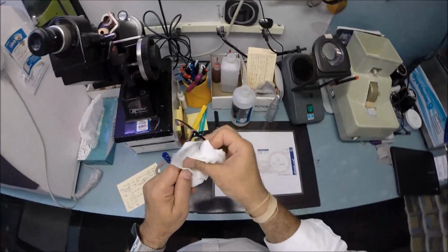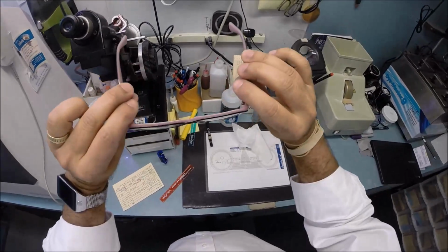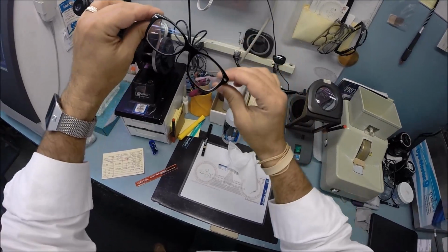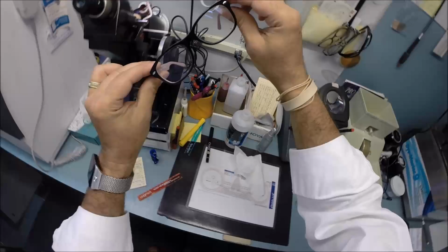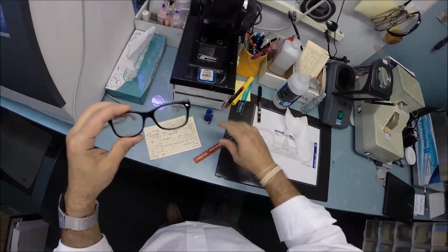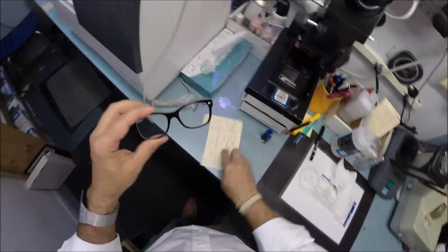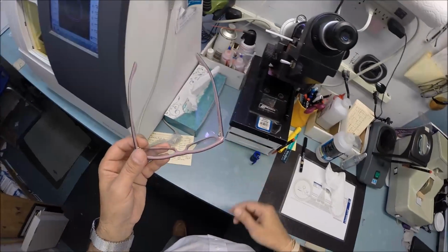So, oh yeah, when you get these in the mail, there is a small chance that these could fit too loose or too tight. But there's an 80% chance that one side is going to sit higher than the other. That is because 80% of people, that's my wiggle dance, 80% of people have one ear that is higher than the other. Because of that statistic, 99% of all optical shops will do free adjustments if you ask them. But I'm going to get them in standard alignment first, also known as a 3-point stance.